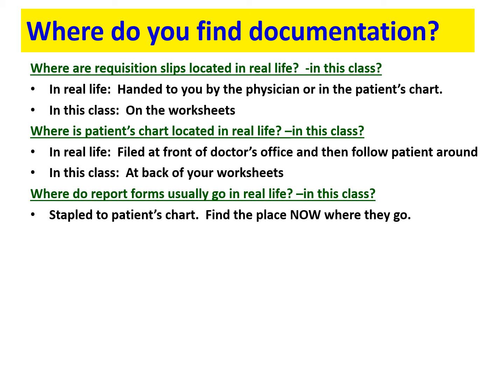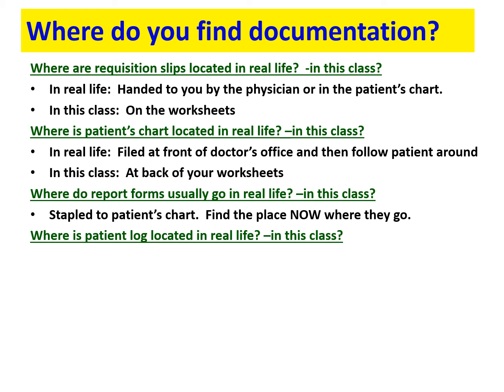And make sure that you look, because there are charts for each one of the patients, whether it's John Doe, Jane Doe, or your lab partner, that we have in our worksheet that we're responsible for homework, making sure that we do our charting and our documentation. Make sure you're familiar with all that, like I tell you in lab.